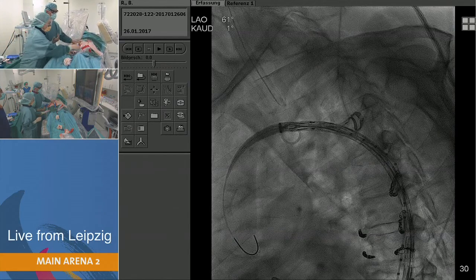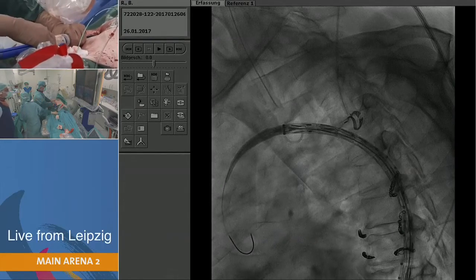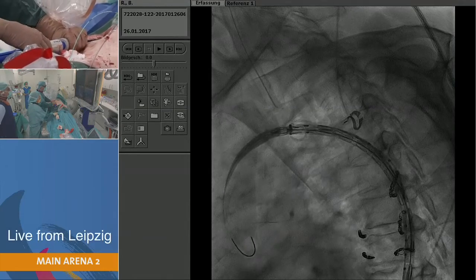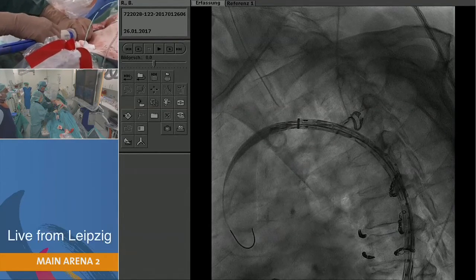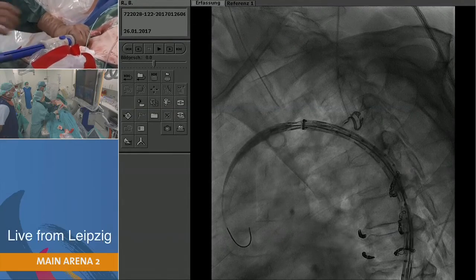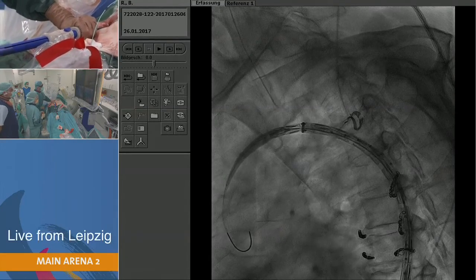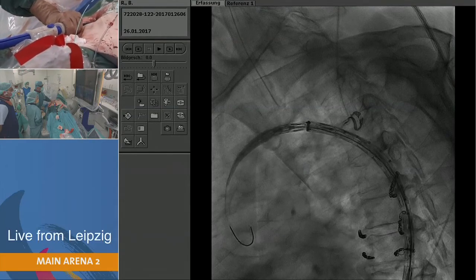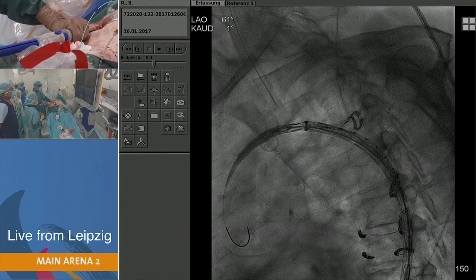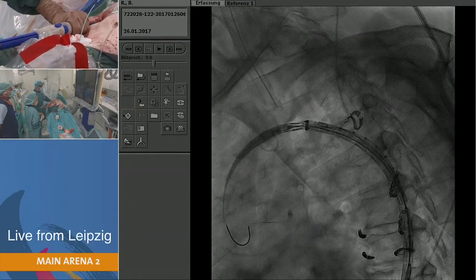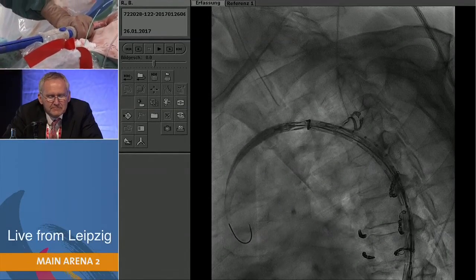We are going to deploy with rapid pacing. Are you concerned the bare struts of this stent may fall into the subclavian? It could happen. The struts are short and coated with PTFE — they don't have hooks, so they are relatively benign. It looks ugly, but I haven't seen a complication from it. Me neither. Okay, I think we are just about to start now — starting rapid pacing, please.